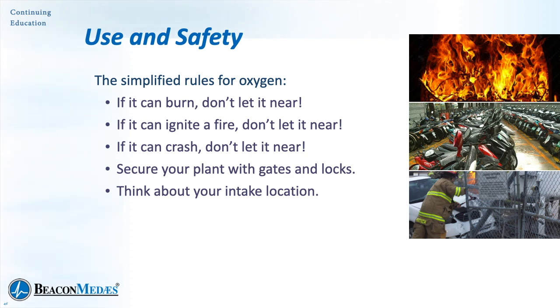We want to make sure we think about the location for the intake. If we're running a concentrator, yes, it will remove all the nasties, the negative gases, the toxic gases that are present in ambient air, but we don't want to challenge it more than it needs to be, because of course all that stuff can damage the zeolite. So we want to make sure we get the best available clean outdoor air.